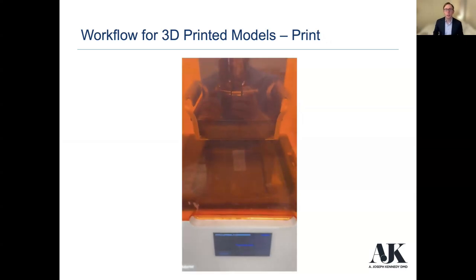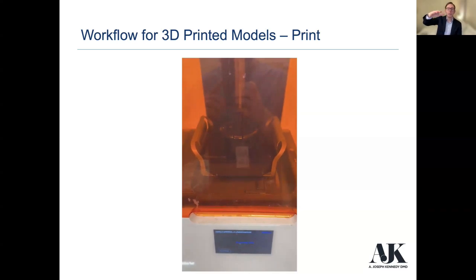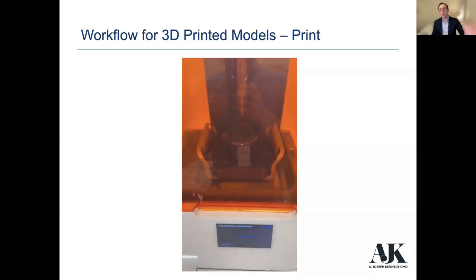So I just wanted to show a video here just briefly. I think it just solidifies the idea that we've got this LED in the bottom, build platforms coming down. There's a little resin arm that just kind of keeps the resin moving and flowing. And as you'll see here, the build platform will sink all the way down, and then it'll snap a quick photo in just a second. And then it'll raise up again. The resin arm will move and kind of keep the resin flowing so it's not all curing, and then the build platform will go down.